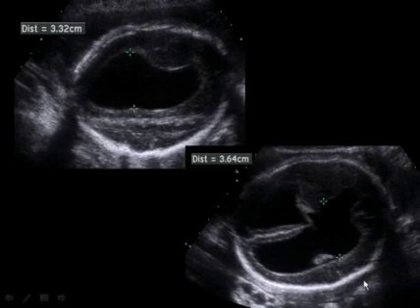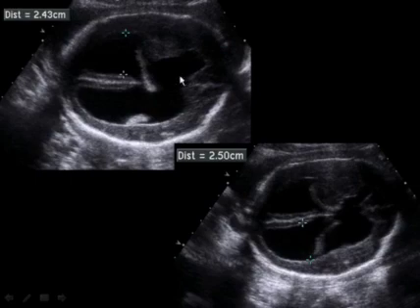Here's the same fetus in the down ventricle, and we have also artificially increased the size of the ventricle to 36 millimeters because we've crossed the midline, and this is at least part of the third ventricle and possibly part of the up ventricle that's being measured as well. More accurate measurements for this fetus: the falx is right down in the midline, and we're back in the atrium, and we have a measurement of 24 millimeters. And on the downside, again, here's the dangling choroid, the medial aspect of the ventricle, and the lateral aspect of the ventricle, 25 millimeters. Why is this important?